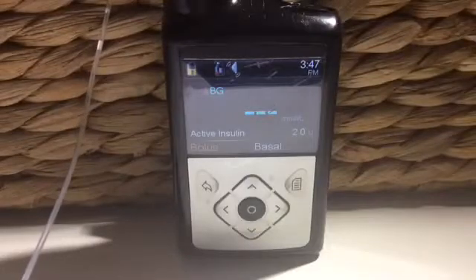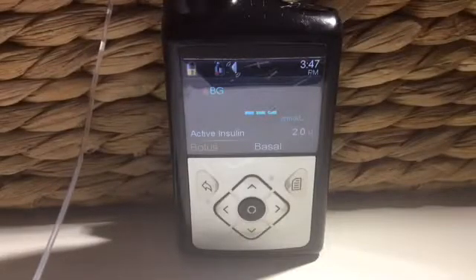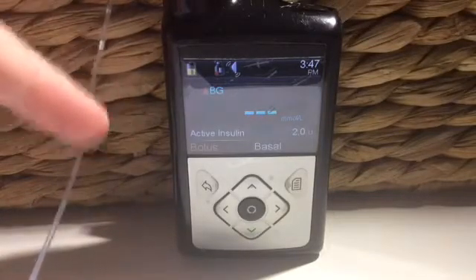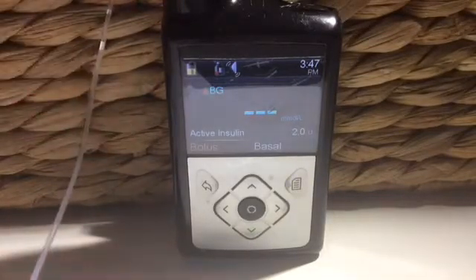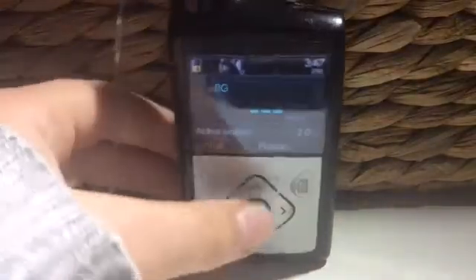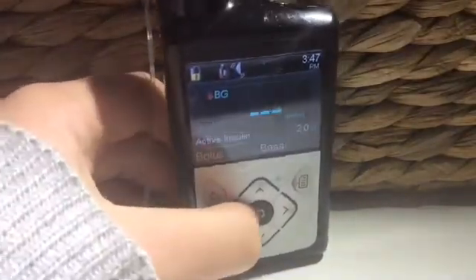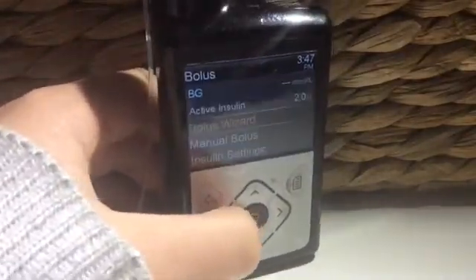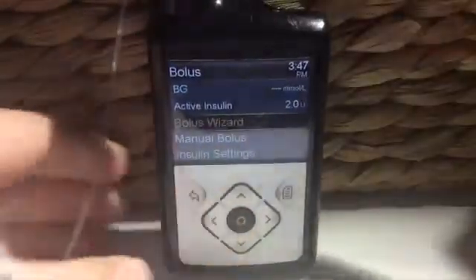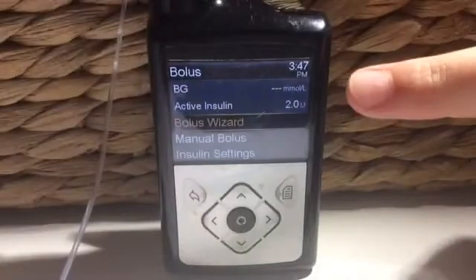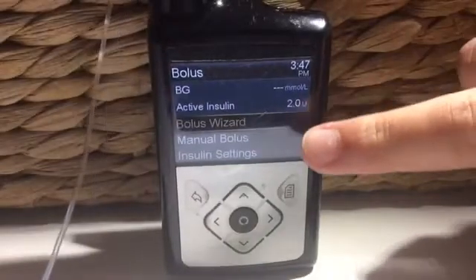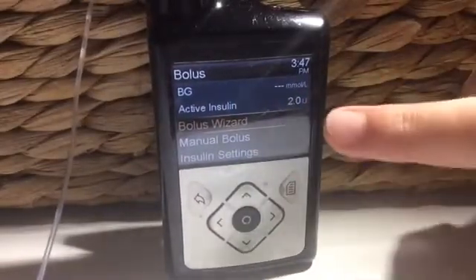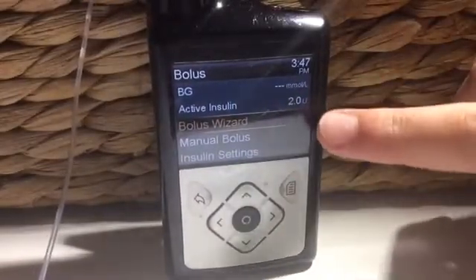So first, the boluses. You'll find the bolus section on the home screen just here, and when you press on it you will see three different sections: the bolus wizard, the manual bolus, and insulin settings. Today we'll just be talking about the first two though.